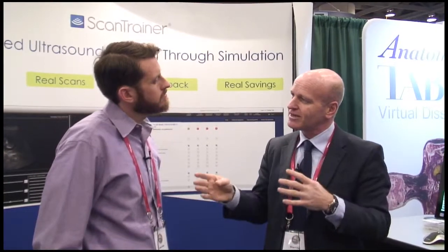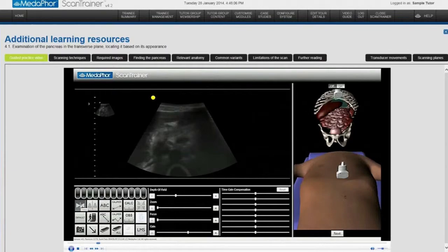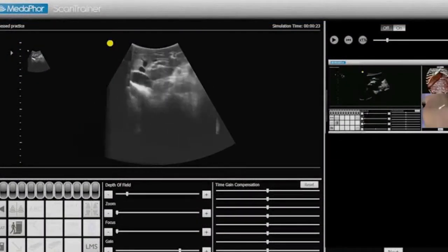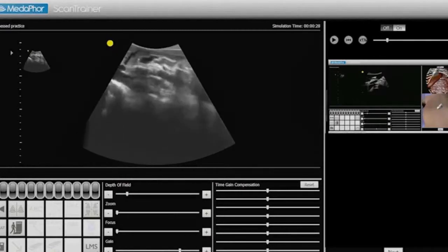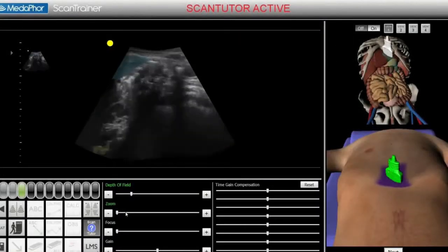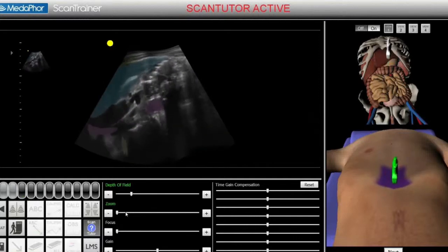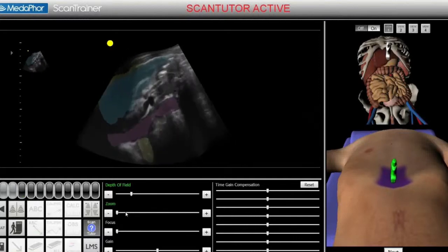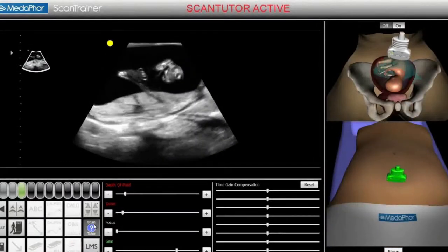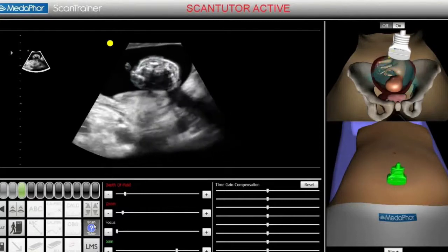So as you're scanning, if you're struggling to understand how to acquire the image, you activate the scan tutor button. It brings up a colour guidance system that shows exactly where the structure is in real-time, live in colour on the live image. It guides your hand by showing exactly where you should be scanning — the position on the body and the actual orientation. When you've finished, it gives you feedback on how you've done, measuring every single thing in real-time: position, pressure, whether you've measured anything correctly, and whether you've got your alignment correct. You can then find out whether you've scanned to a proper clinical level.